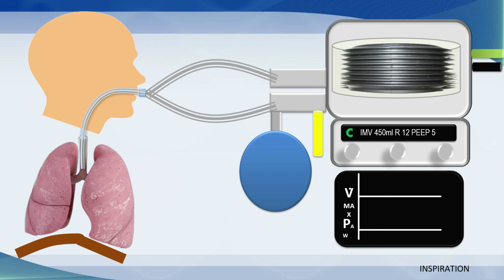As flow is going around the system continuously, that bag acts as a reservoir for inspired gas, just like a non-rebreather face mask is. The bag fills up during that window between inspiration and expiration. The gas is flowing all the time.